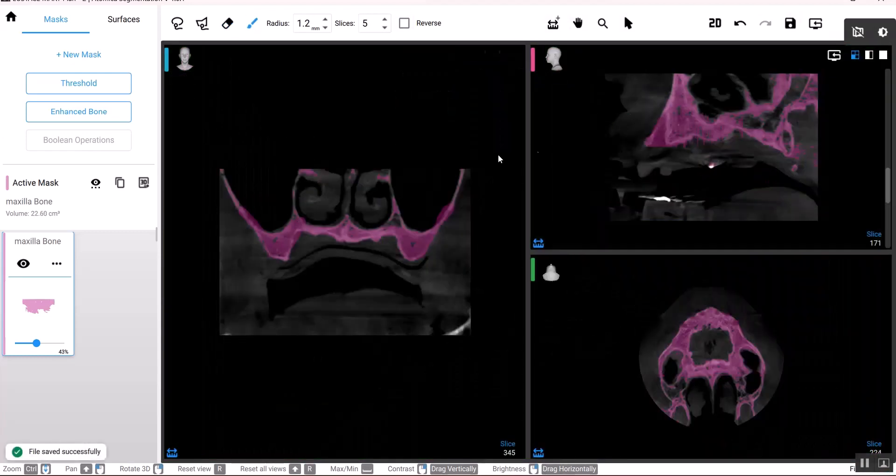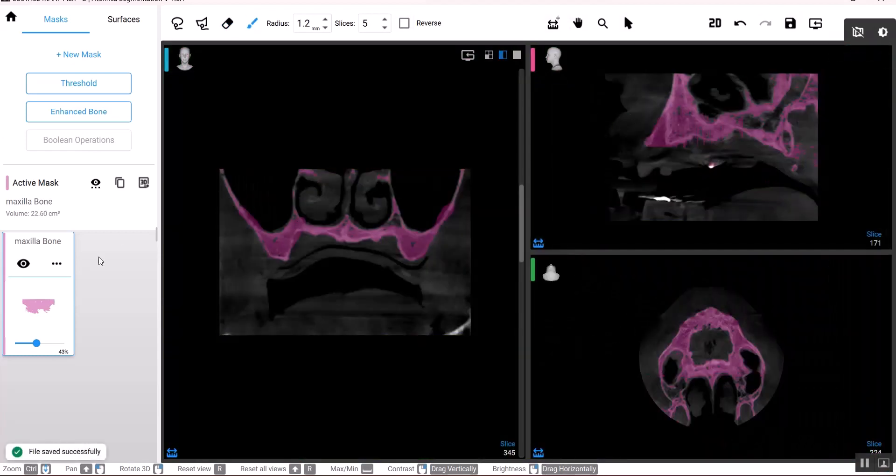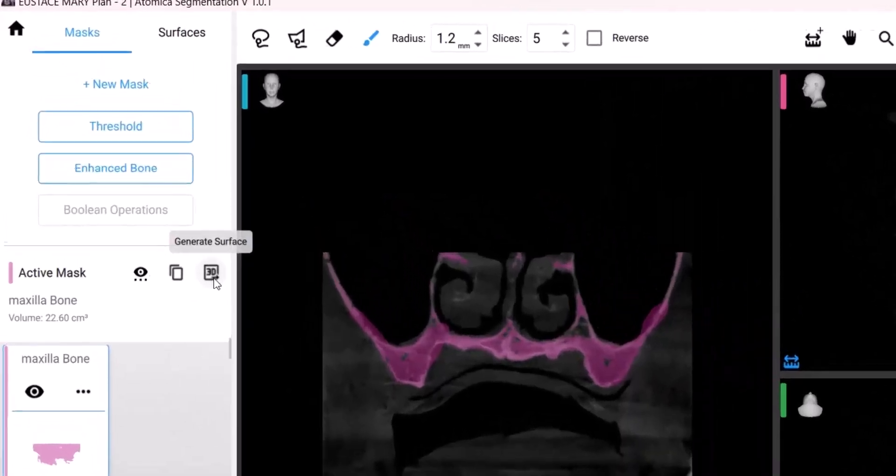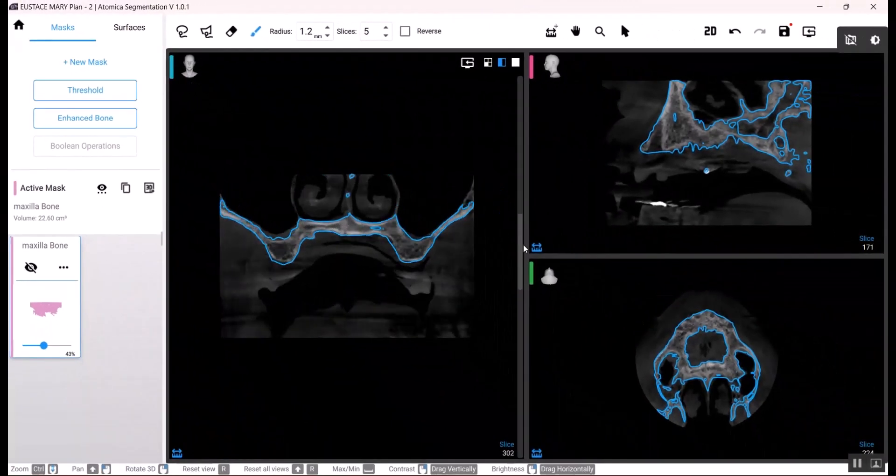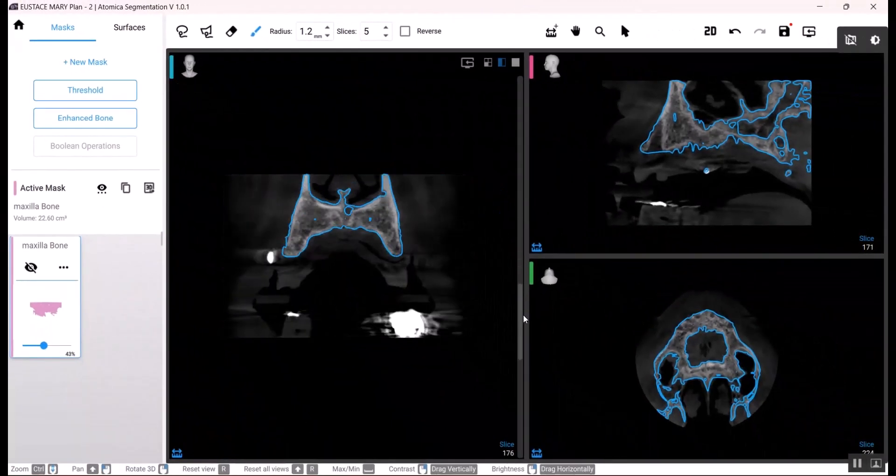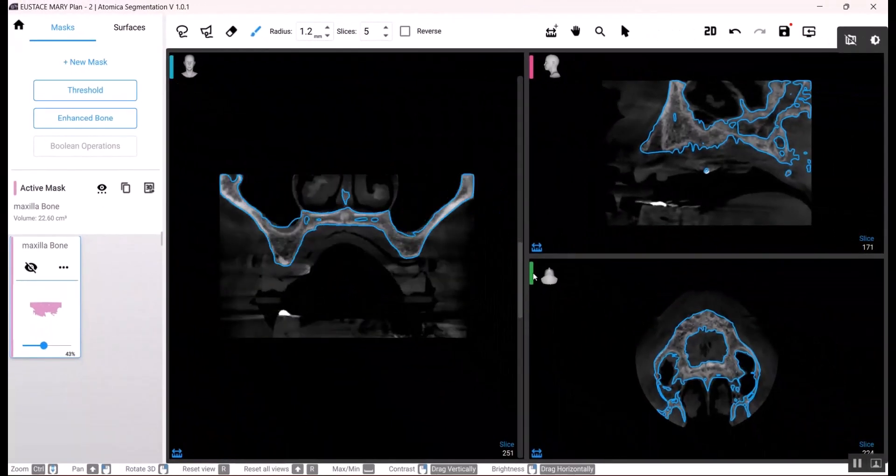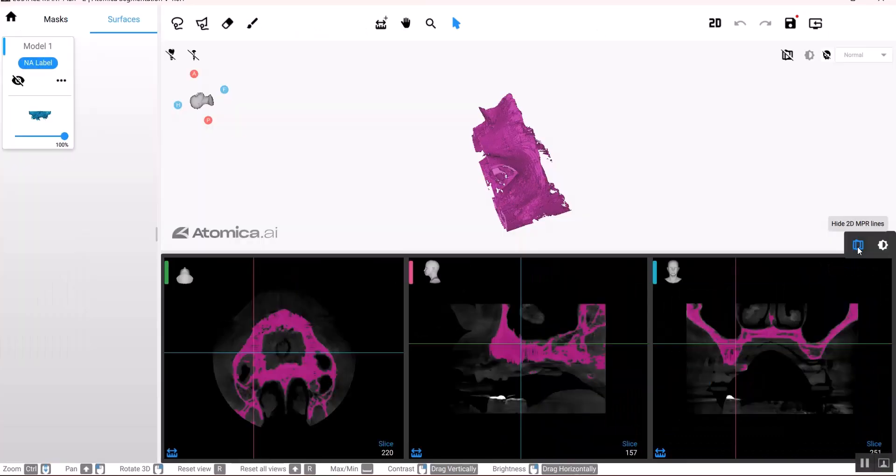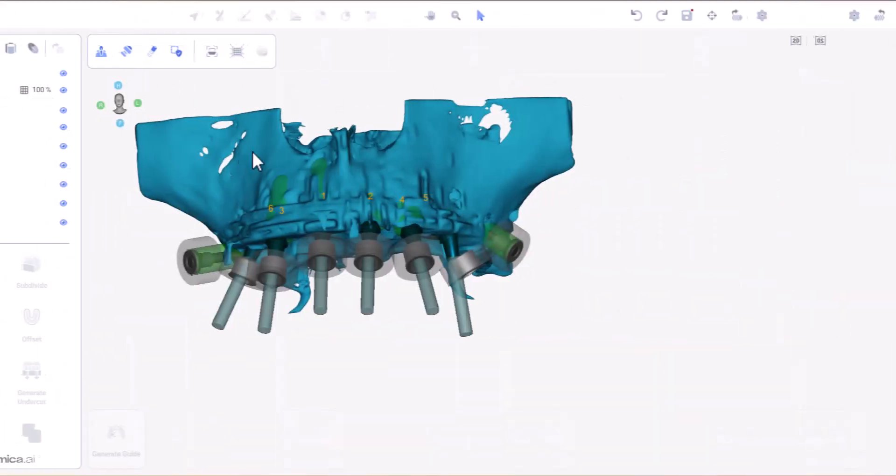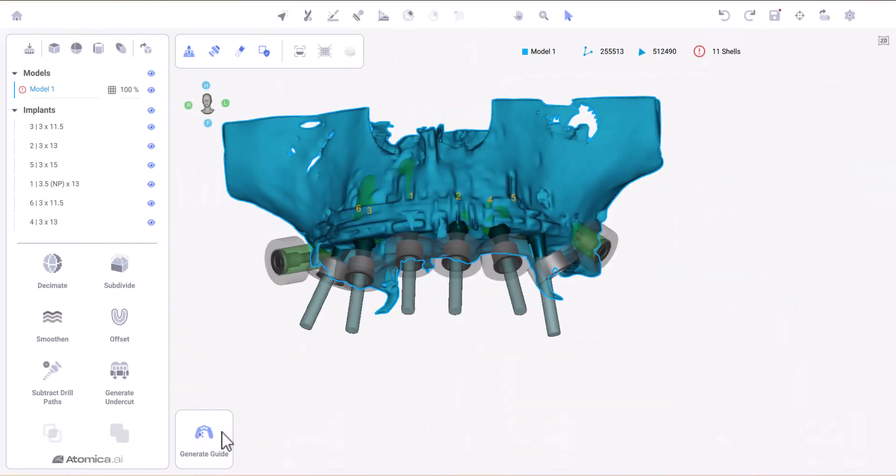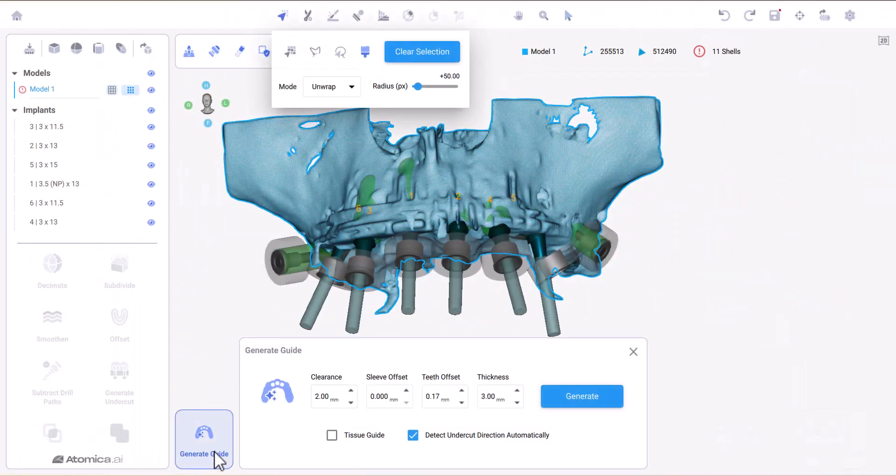Now when you save the case, you can head to the design app where you can easily generate the guide.